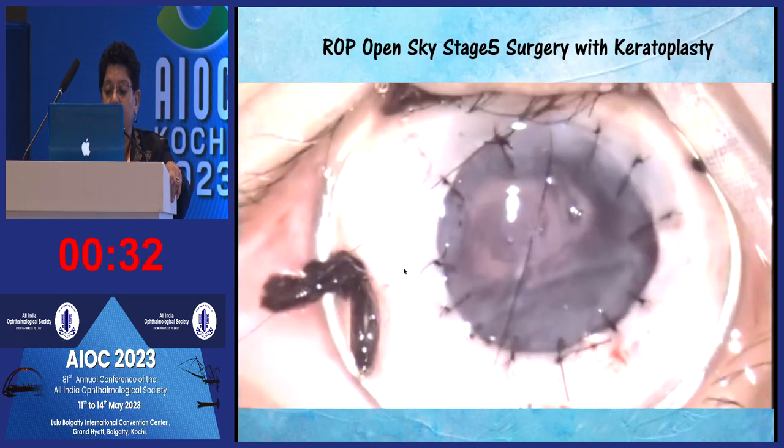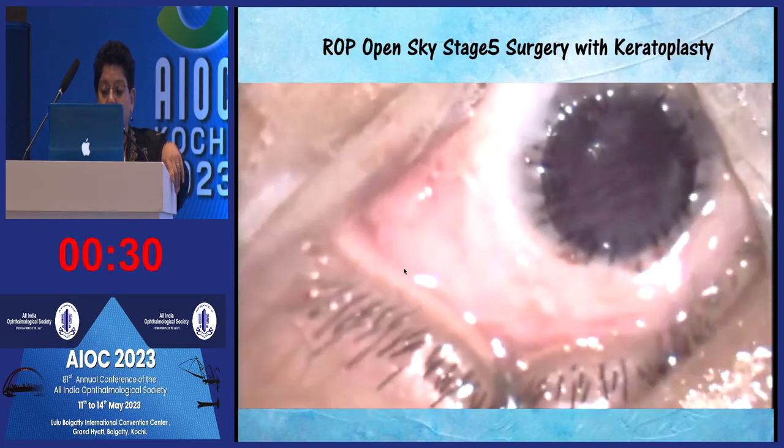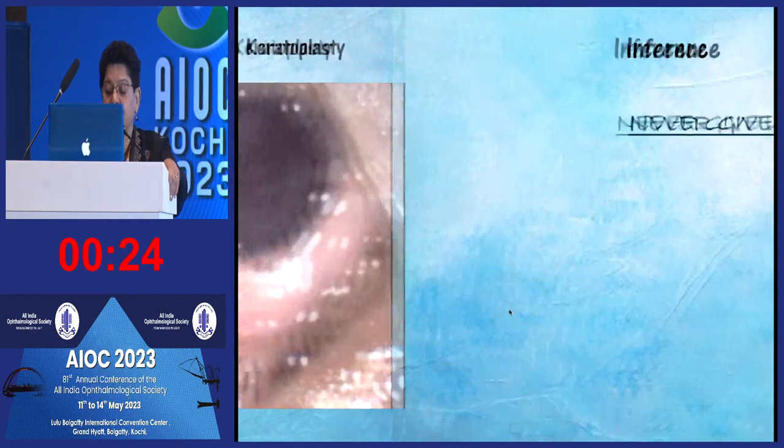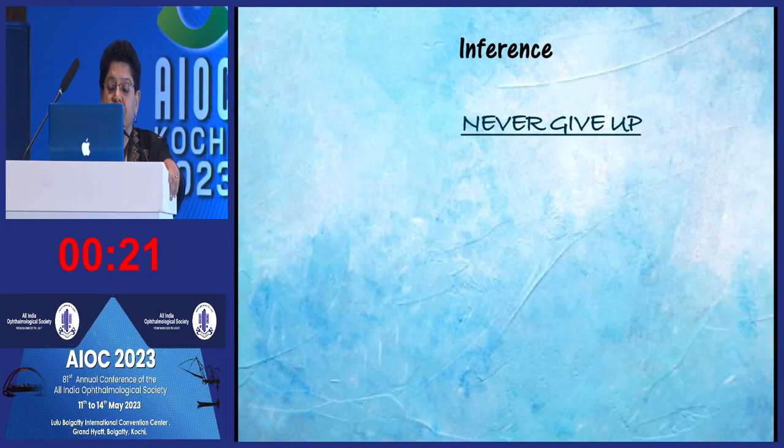and then afterwards you put in your high viscosity solution and suture the lens in place, suture the cornea in place. So the inference is, however bad it looks, if the person has a chance, never give up. Thank you.